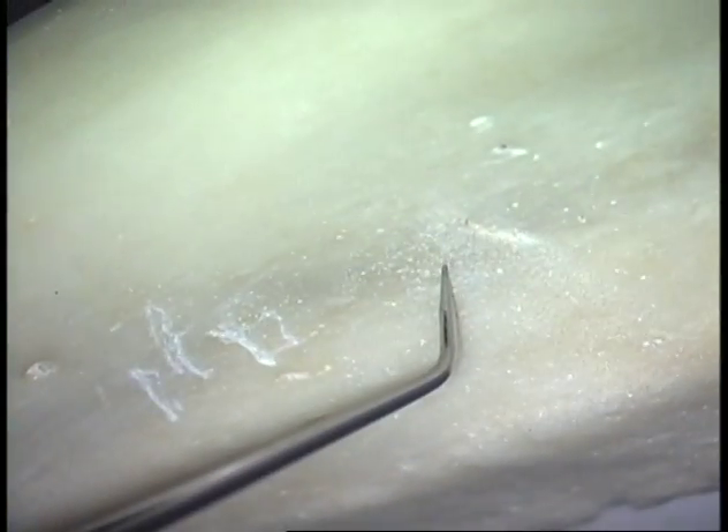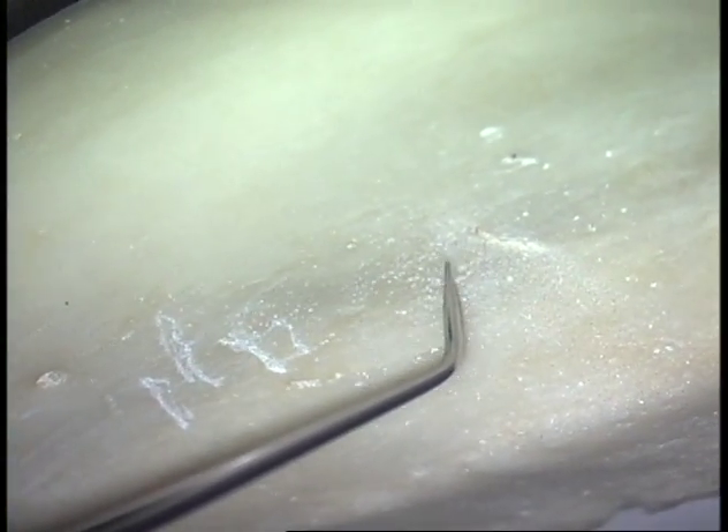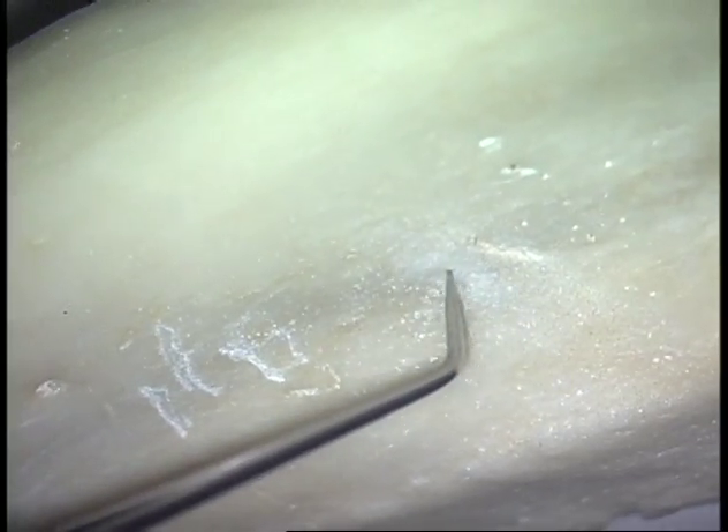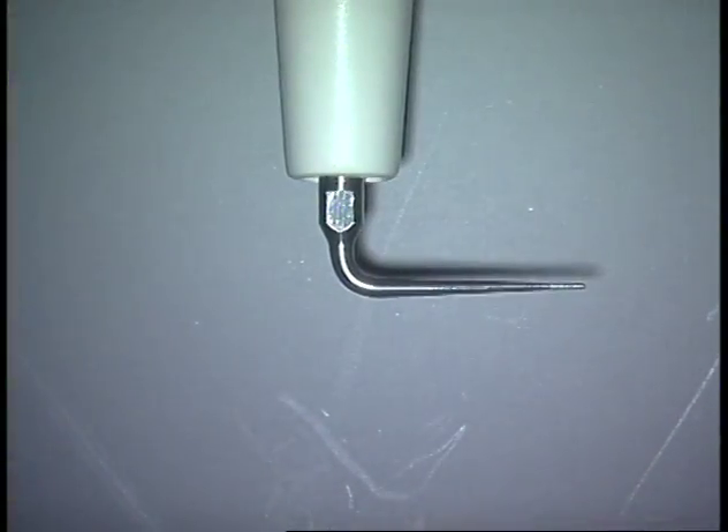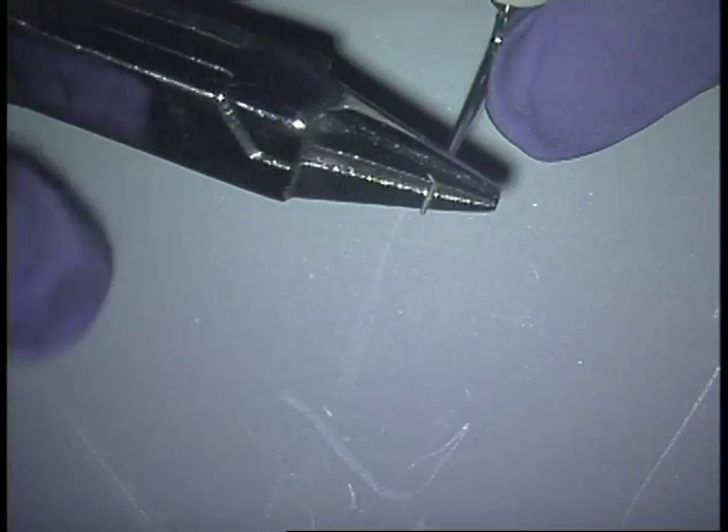These have been specially treated to be able to tolerate these kinds of bends. You'll do this with water, but this is just to demonstrate how they cut. Even the diamond tips can be bent like this.